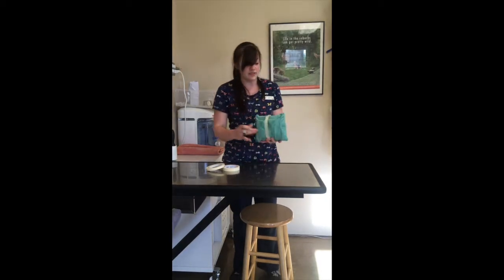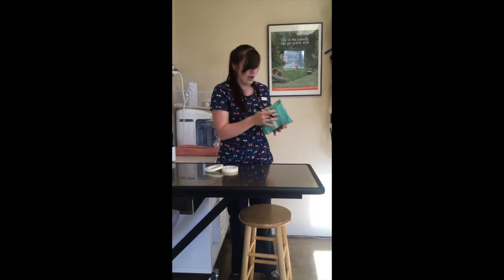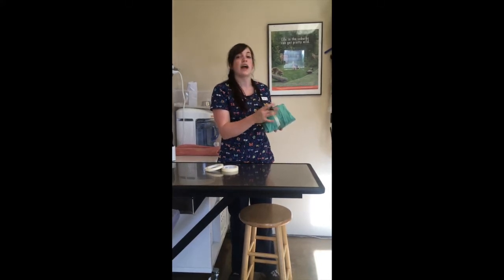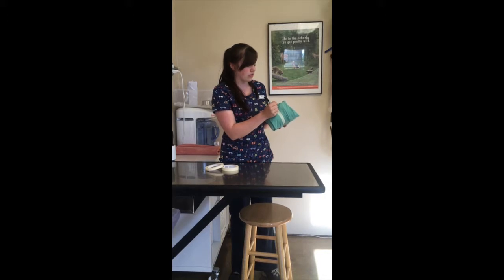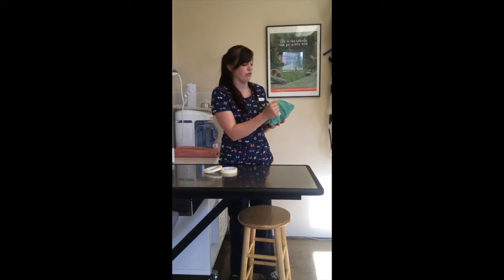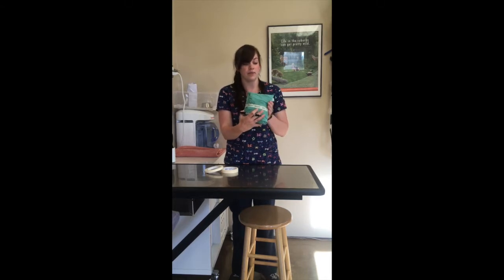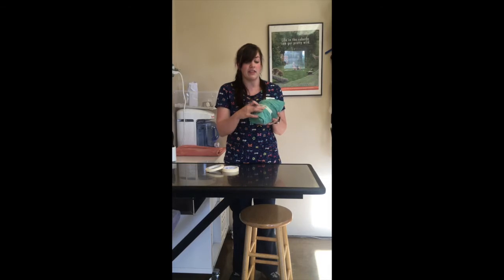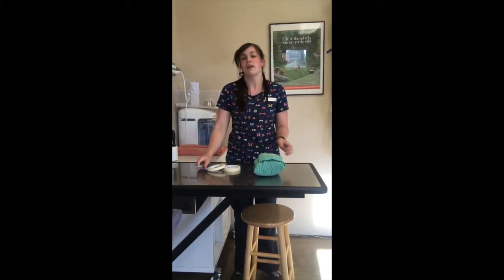So I'm going to label it with today's date. And then I'm going to go ahead and put what kind of pack it is. So this is a surgical gown. And then I'm going to go ahead and put my initials. So if there's anything wrong with this pack, they can come to me with any concerns, questions, or tell me if I were to have not included the indicator strip, anything like that, so we know who wrapped the pack. And that is a properly wrapped surgical gown.